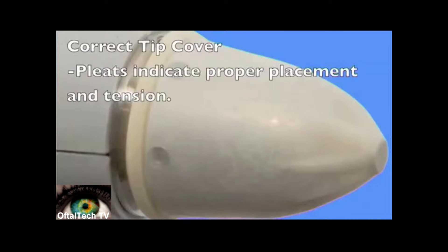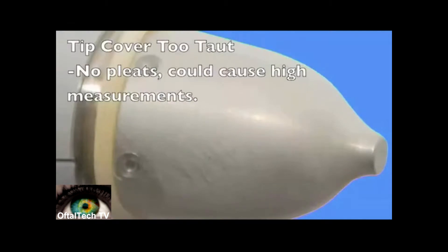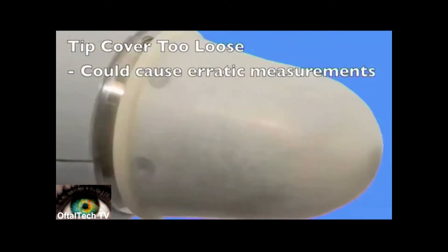Pleats indicate proper tension while allowing the transducer pin to move freely. Tip covers that are too tight could introduce false resistance to the transducer pin and IOP measurements could read higher. Tip covers that are too loose can fold over or crease and possibly create erratic measurements with your AccuPen tonometer.